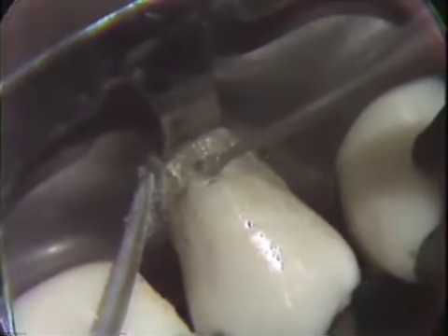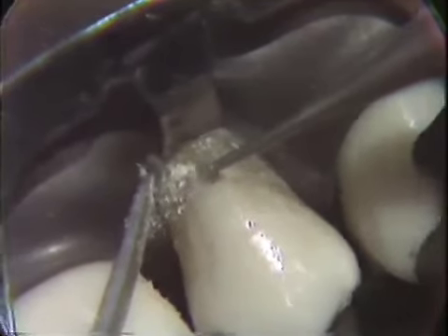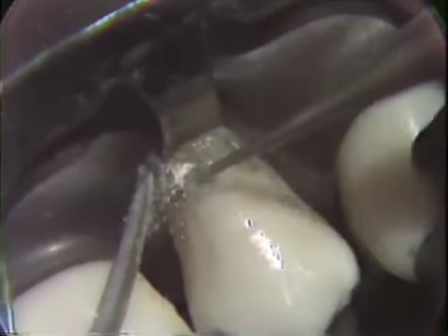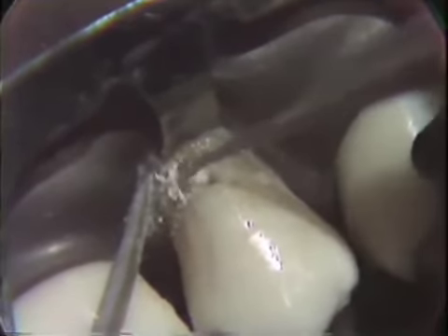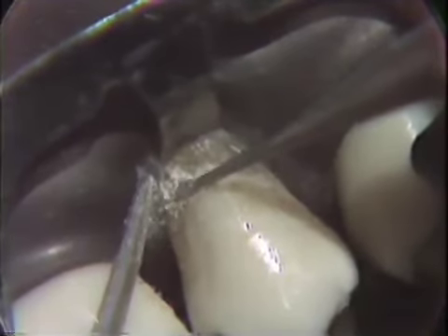Again, this is forming the two sides of the trapezoid, one side having been formed with the mesial wall, and the distal wall now just about complete.